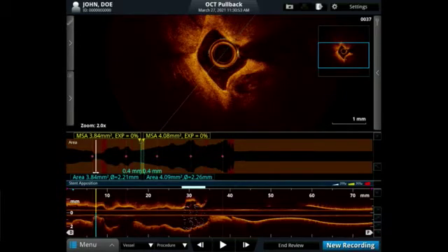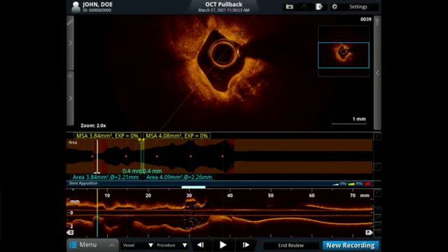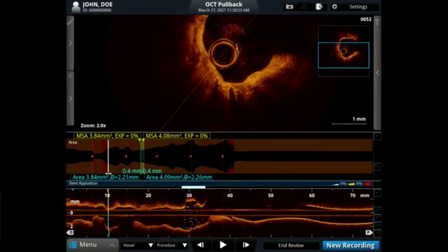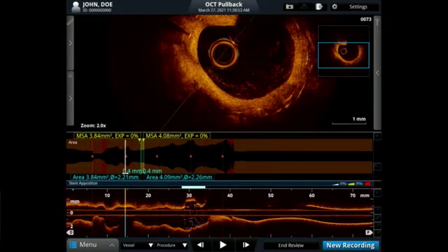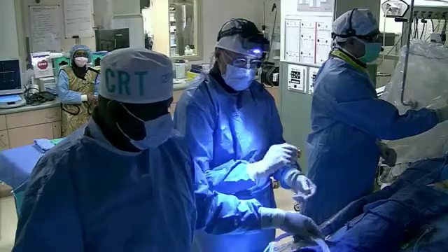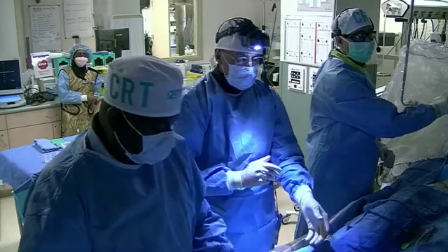Yeah. So we see if these nodules disappear. You see it now? No, we're not going to get the OCT yet. I'm looking at the old scan. Now look at it. See if you can get the lenses aligned, so we've got the same view. Yes, sir. But look at it though, for the distal segment.